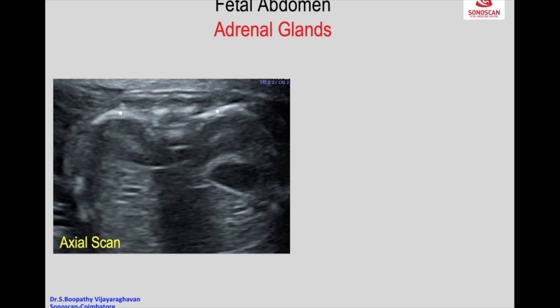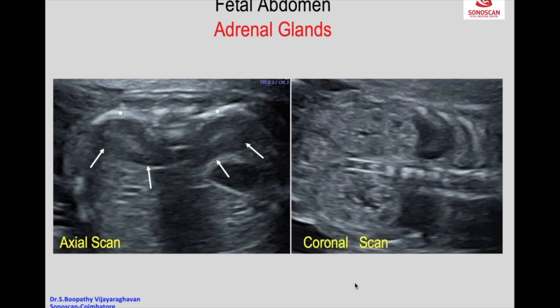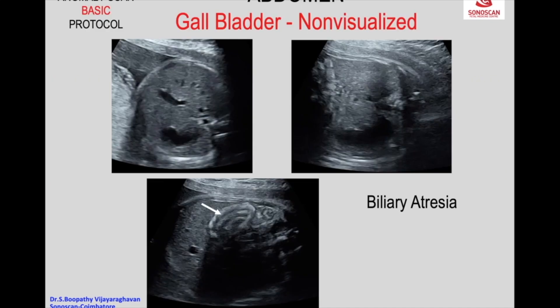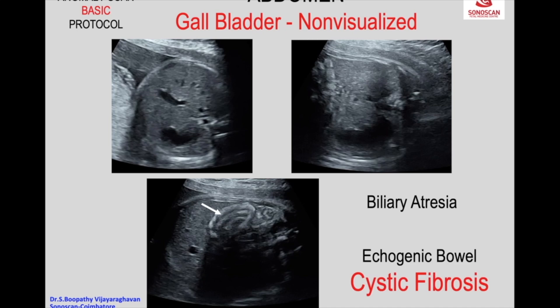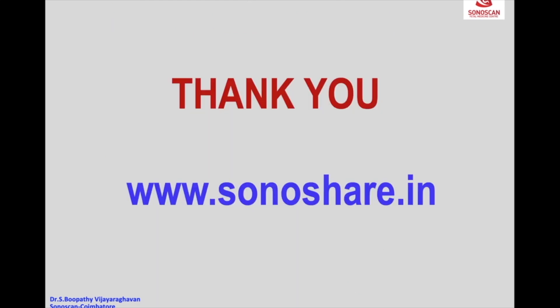The adrenal glands can also be seen. On the axial scan above the level of the kidneys, you see the stomach. Above the level of the kidneys, you see the adrenals — echo-poor oval structures on either side of the spine with a central echogenic area. In the coronal scan you see the echogenic bubble. The combination of a non-visualized or absent gallbladder with an echogenic bubble gives a very high risk for cystic fibrosis. When you see both together, invasive testing and genetic investigation to rule out cystic fibrosis must be done. This was a case of non-visualized gallbladder with echogenic bubble which turned out to be cystic fibrosis on genetic testing. Thank you for your attention.